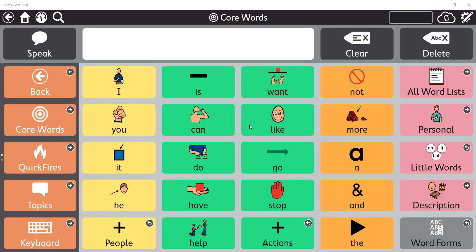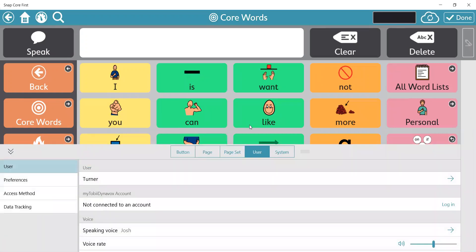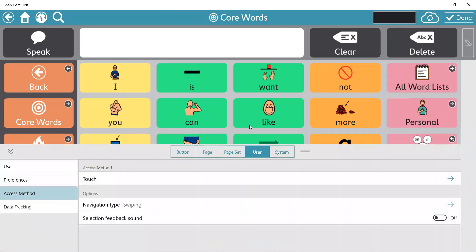I've opened up my user, and I'm going to go to the edit, which is the top right button — the cogwheel with pencil — and I'm going to go to user and access method on the left-hand side.